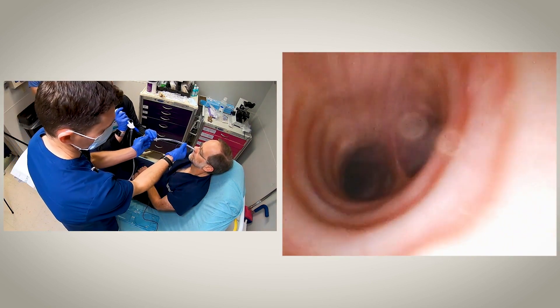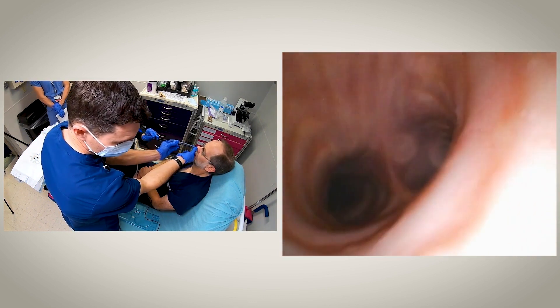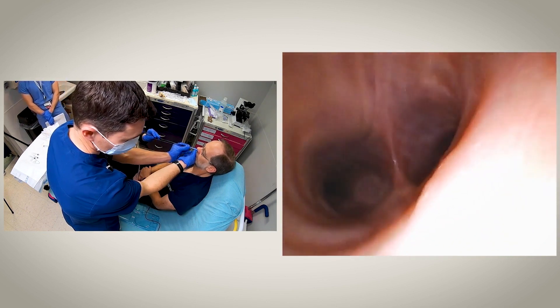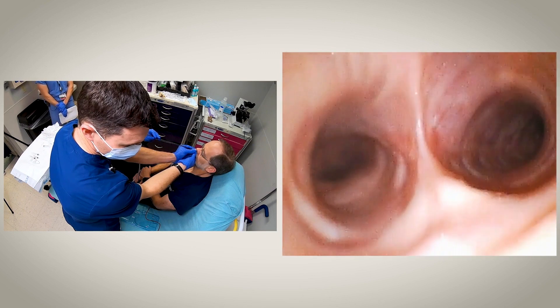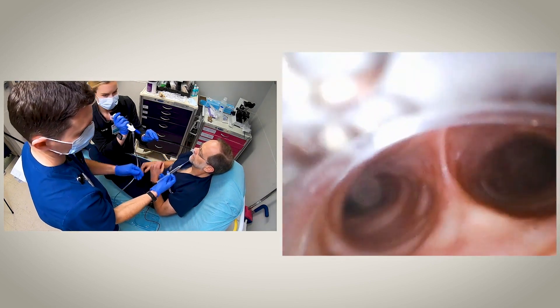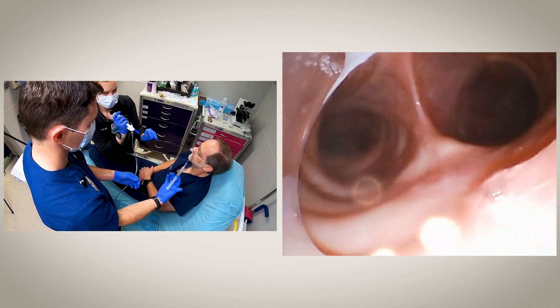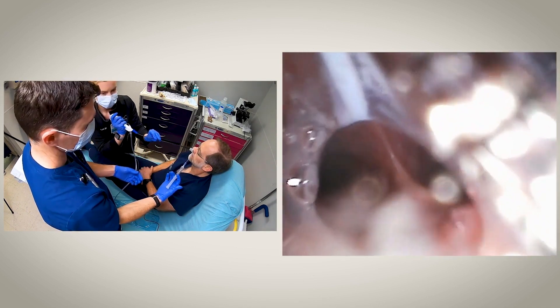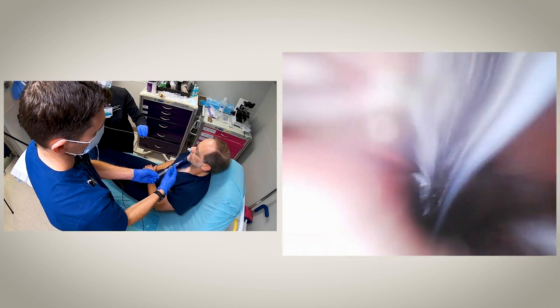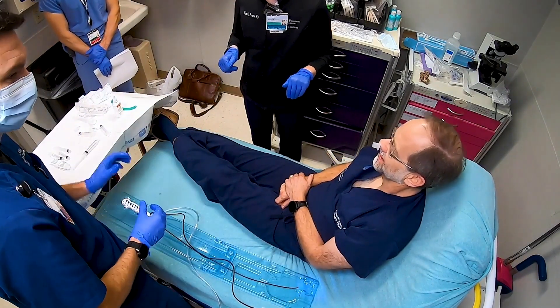This is generally a two-person technique where the bronchoscopist is holding the scope and visualizing the airway, while the assistant advances the endotracheal tube down through the cords. For most adults, you'll have to advance the ET tube almost to the hub to get it into the airway — and here we can see it appearing on our screen just above the carina. We can measure the distance from the carina to the endotracheal tube to ensure it's at an appropriate location. We can now withdraw the scope, inflate the balloon, and that is how an awake fiber optic nasotracheal intubation is performed.